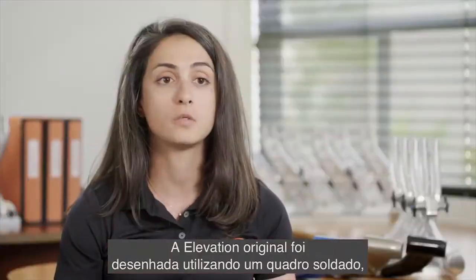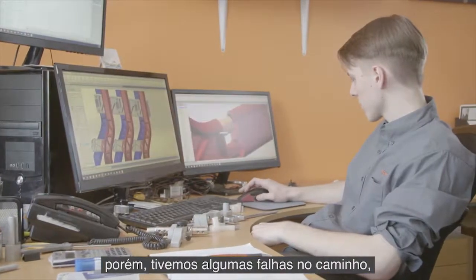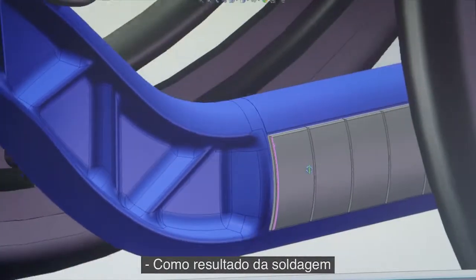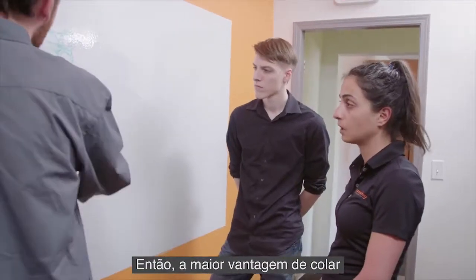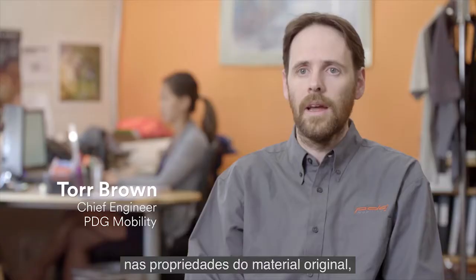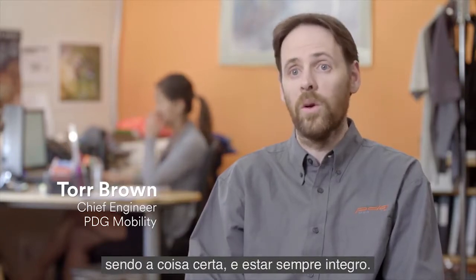The original elevation was designed as a welded frame. However, we had some failures in the field — there were failures in the heat-affected zone. As a result of welding, you actually change the metallurgy in the parent material. The big advantage of bonding is that you don't get that change in the parent material properties, and as a result, you can count on that material always being right.